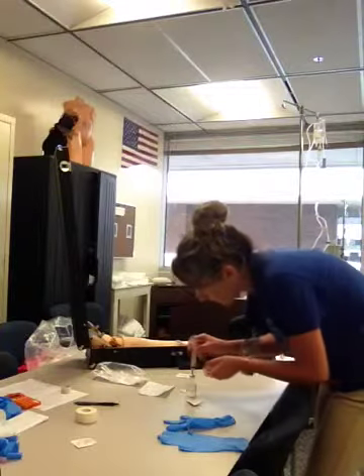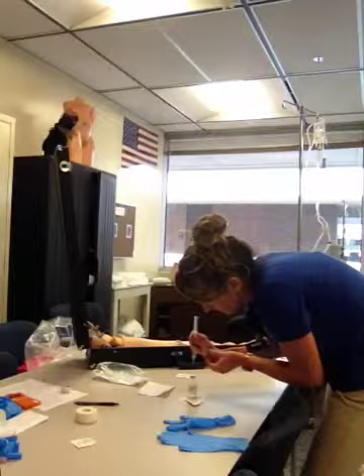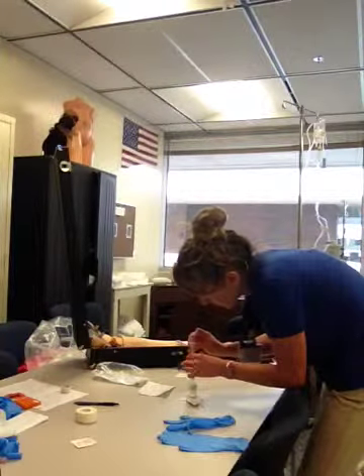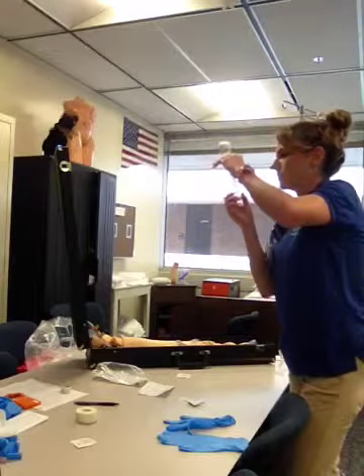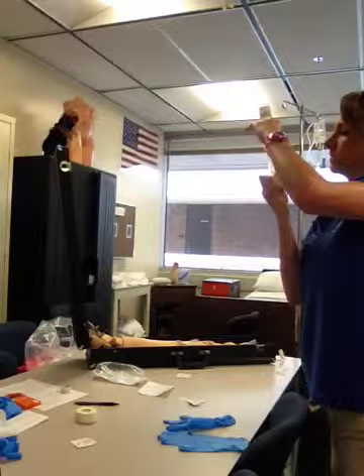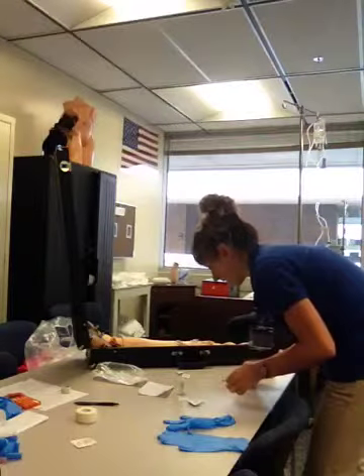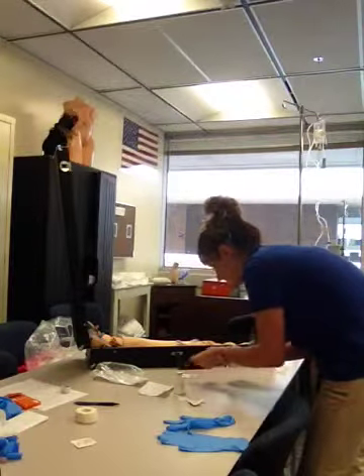I'll use the flush. Saline. My meds, my labels, and my MAR.